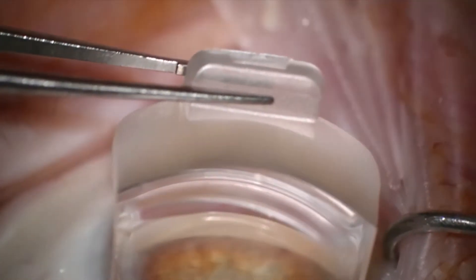You can place the prism on the cornea, get it into position, have a clear wide-angle view of the angle, and then let go. Occasionally you might nudge the lens to readjust your view, but if you want to treat more of the angle you can just shift the prism from side to side in order to get the clearest view.